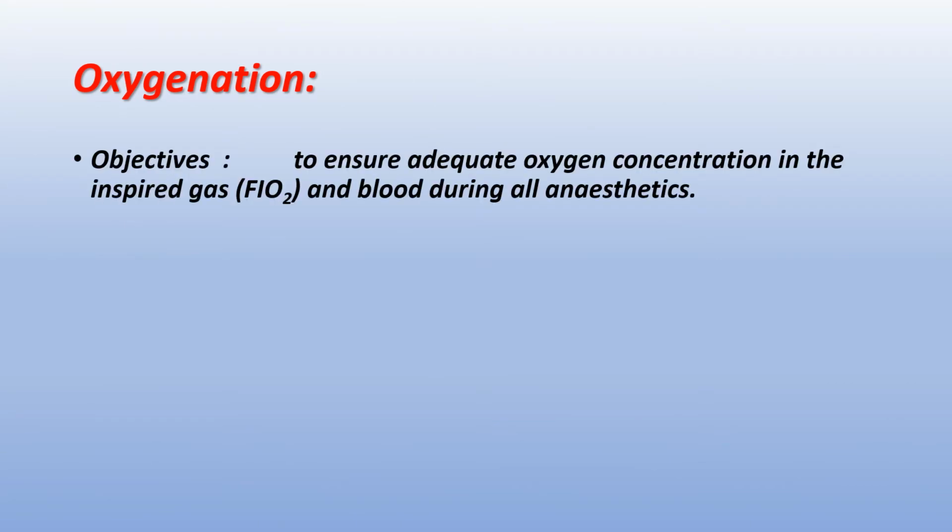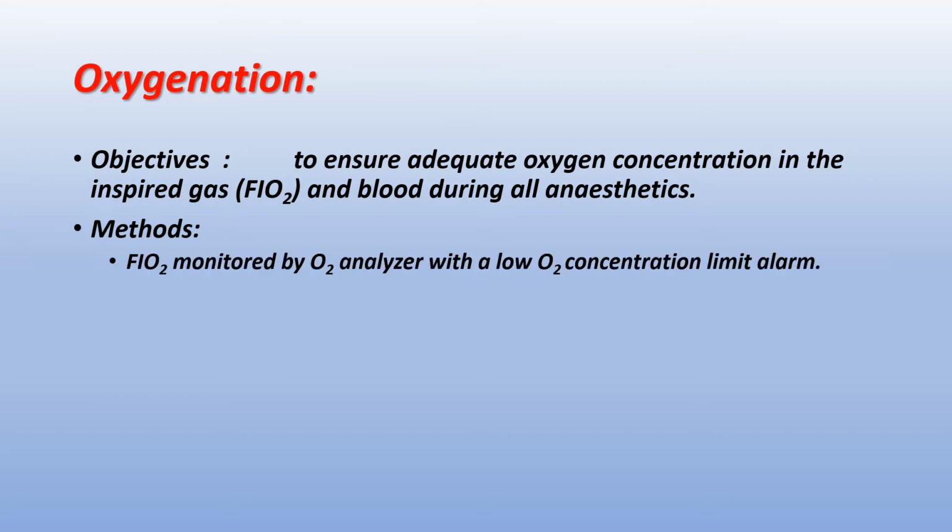We will start with oxygenation. Objective: to ensure adequate oxygen concentration in the inspired gas and blood during all anesthesia. Methods: FiO2 monitored by an oxygen analyzer with a low oxygen concentration limit alarm, so it will be triggered if the FiO2 is reduced. Pulse oximeter. Assess patient color.